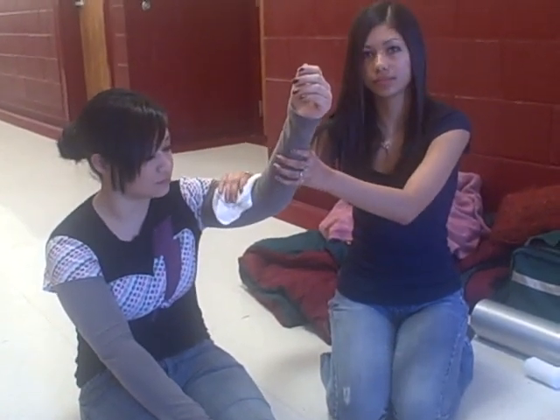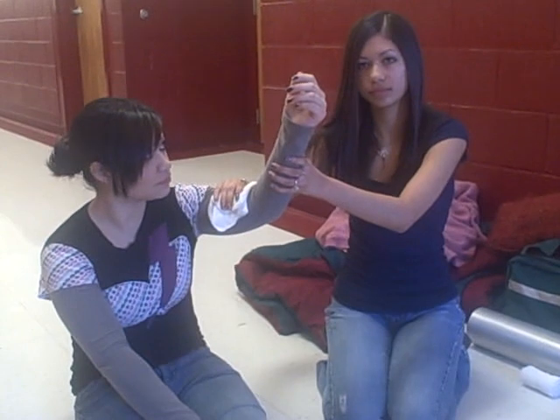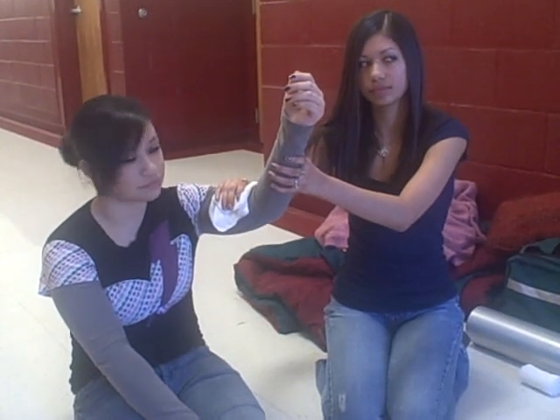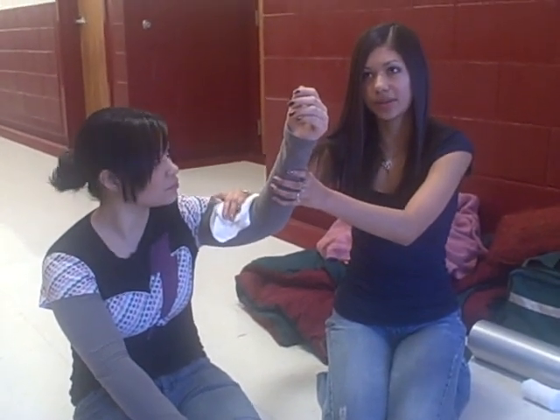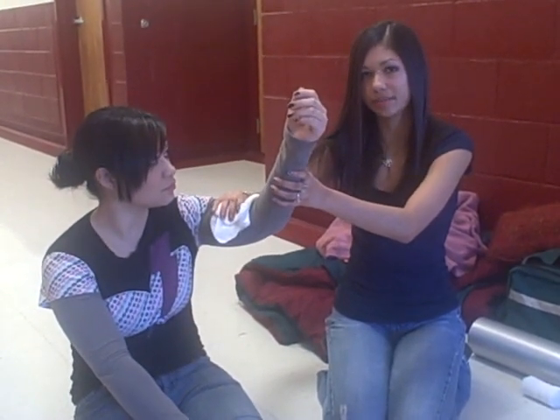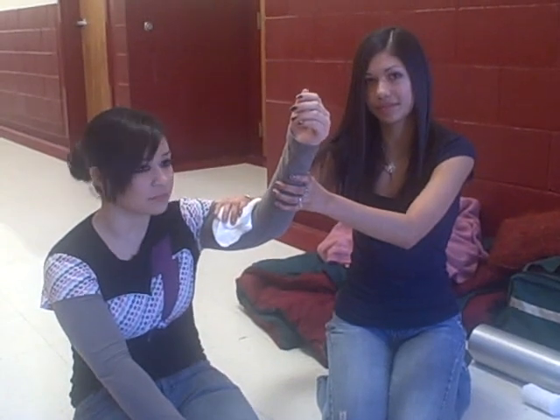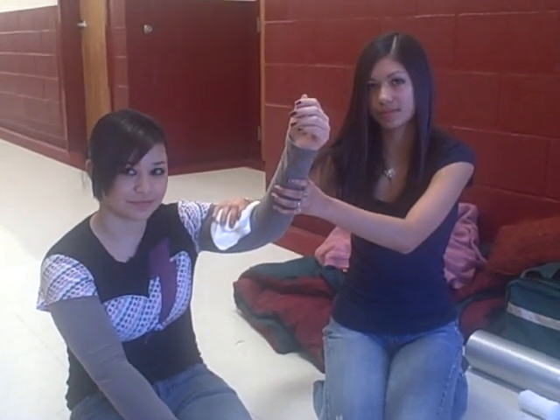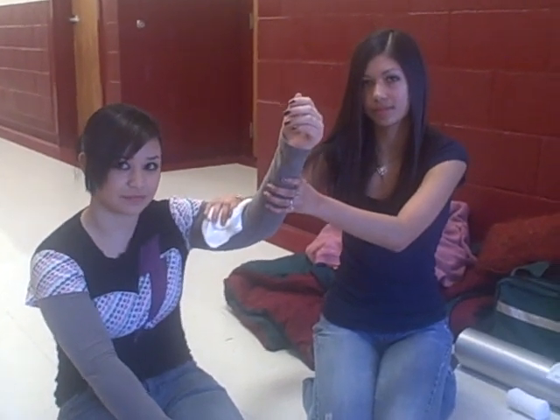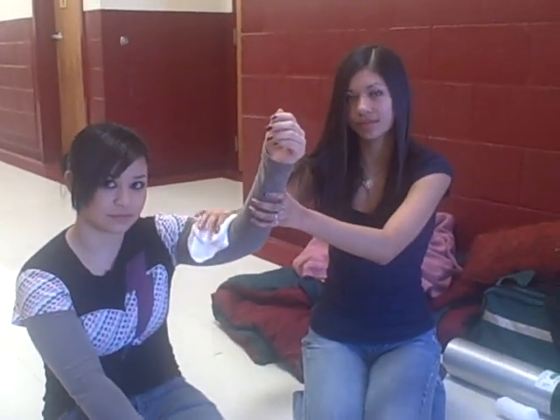The second dressing did not control the bleeding. I apply pressure to the arterial pressure point. The wound is now controlled.